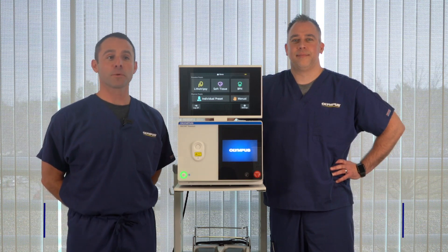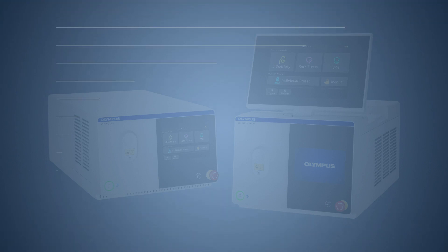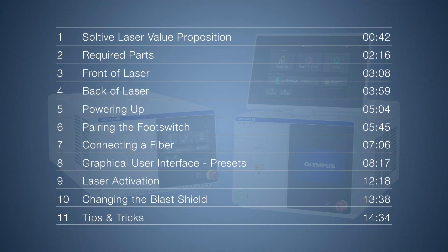Welcome to the Sultiv Super Pulse Thulium Fiber Laser System in-service video. Today we will go over the Sultiv value proposition, advantages of the system, and then get into what you'll need to know about the front and back of the laser, connecting a fiber, the graphical user interface, the blast shield, and then we'll look at some tips, tricks, and troubleshooting.